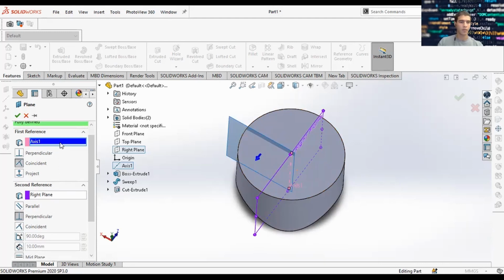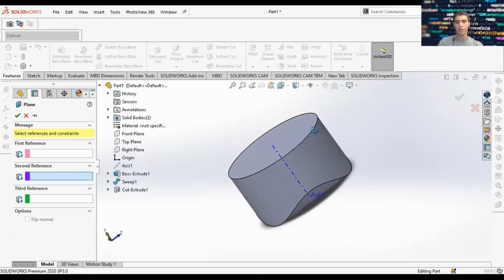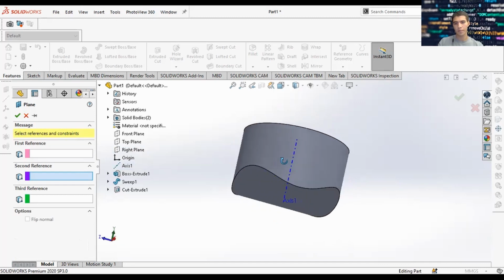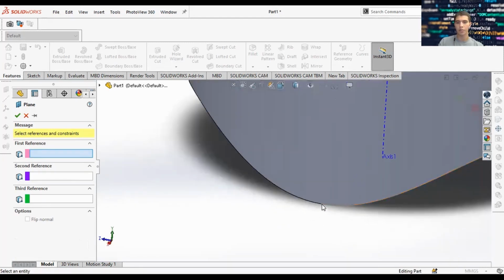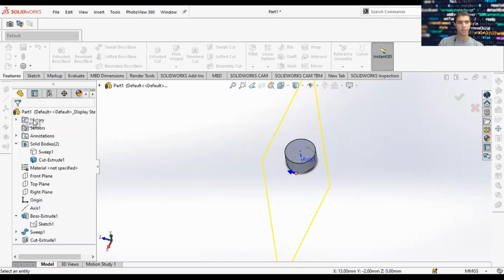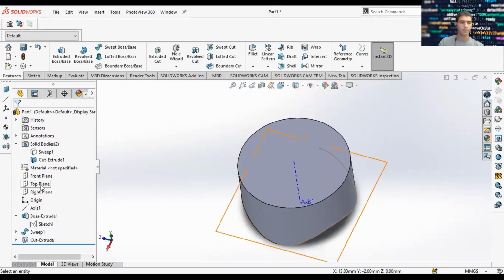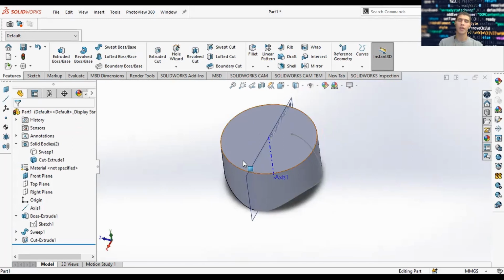And so this reference plane, you want to set it at the beginning of the curve-driven function. So we bring back our curve-driven function, and we set this dot as the initial point. So now this front plane is going to intersect this curve-driven function at that point. So that's good. What we want to do is create a geometry that is offset from that at an angle.